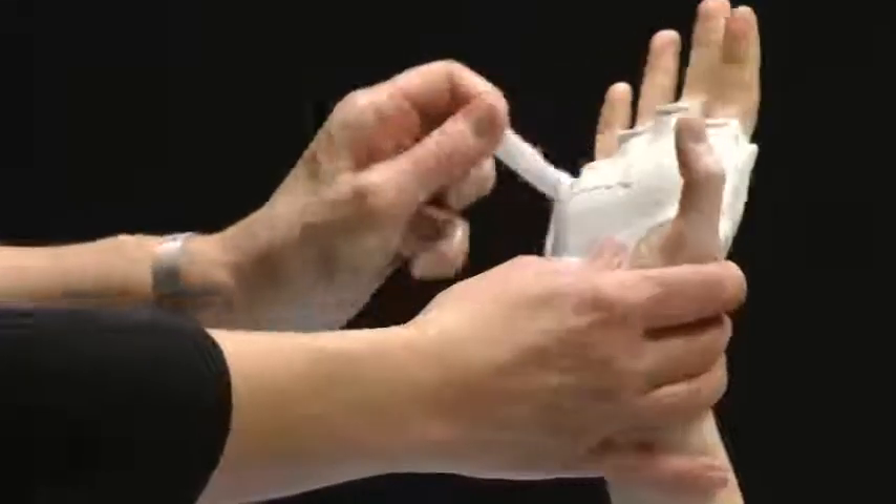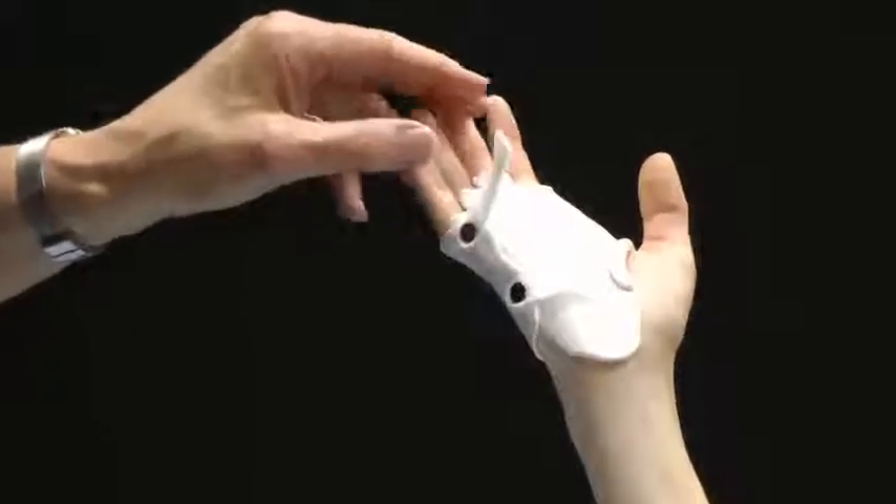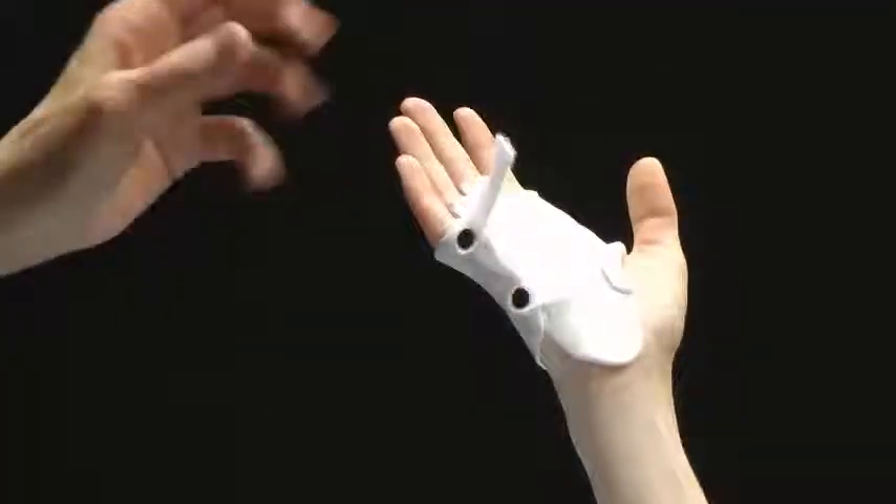To remove it, she takes it off just by opening and sliding out, because if she has flexion contractures and a really stiff hand, she would not be able to slide it out.